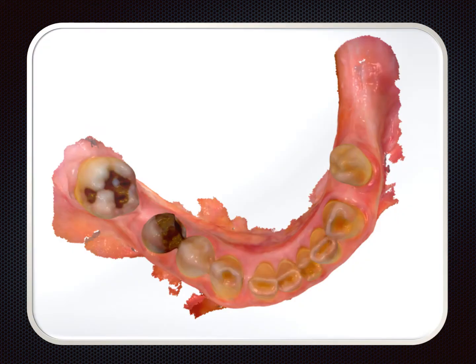Starting with the lower scan, the scan strategy is similar for most intraoral scanners. They recommend starting on the occlusal of a tooth with enough anatomy for reference — a molar or bicuspid. Scan across toward the incisors, then rock back and forth at the incisors, as thin incisal edges don't provide enough reference points. Rock to gather more data, then put the scanner on the buccal for a pass, and roll to the lingual for another pass.